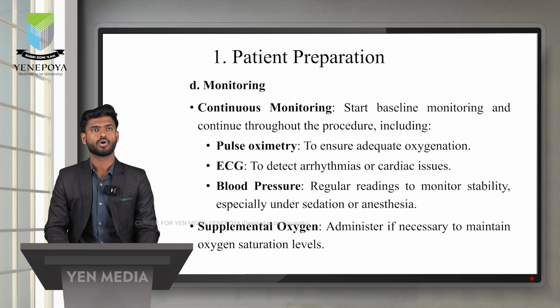For monitoring purposes, continuous monitoring starts with baseline monitoring and continues throughout the procedure, including pulse oximeter, ECG, blood pressure and supplemental oxygen. Administer oxygen if necessary to maintain oxygen saturation.